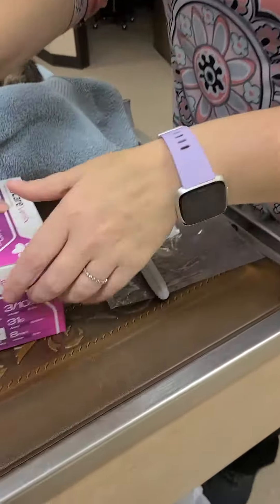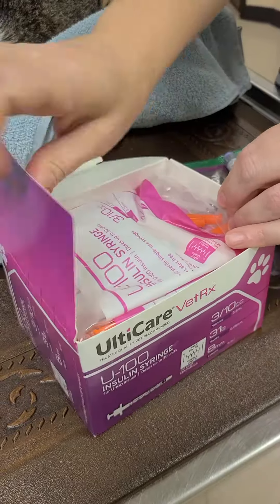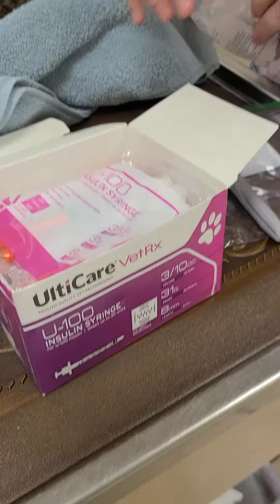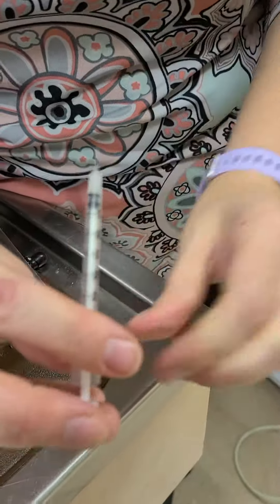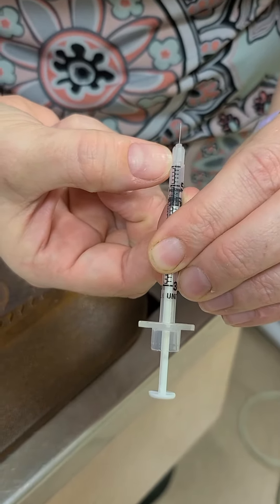This is the Lantus pen. These are the syringes and needles. So you take the cap off the bottom, and then you'll see on this — the very top hash mark, that's zero. Very top one is zero.